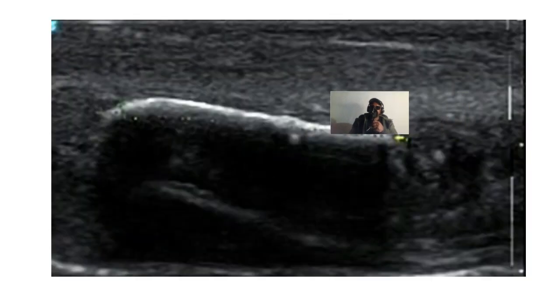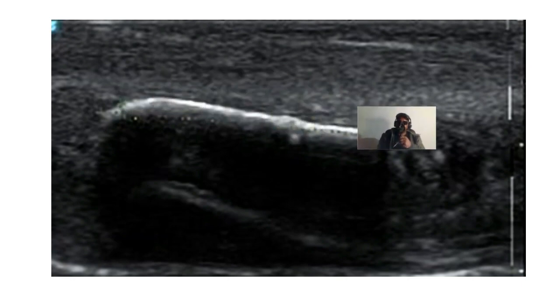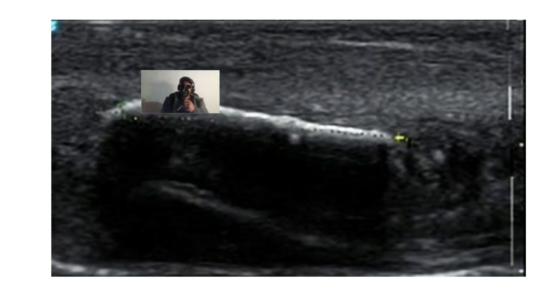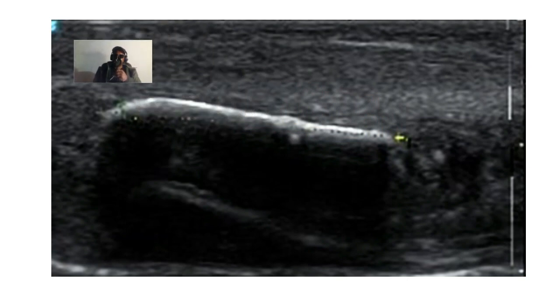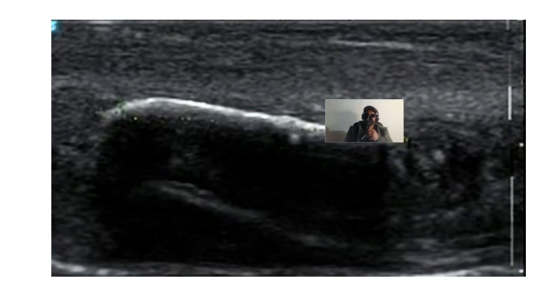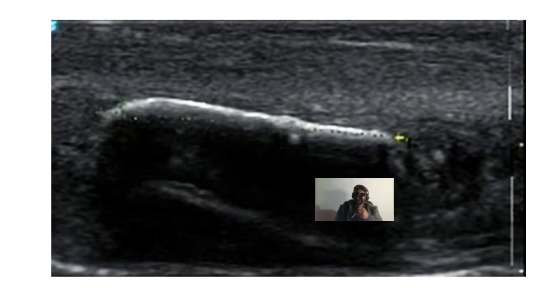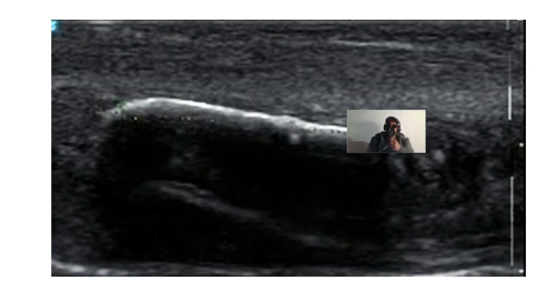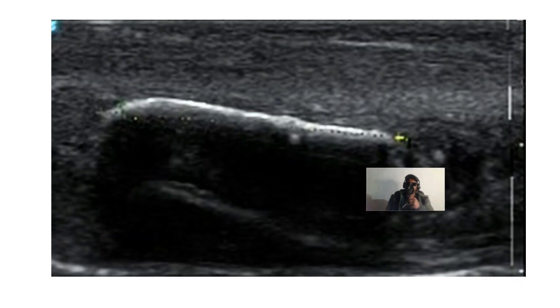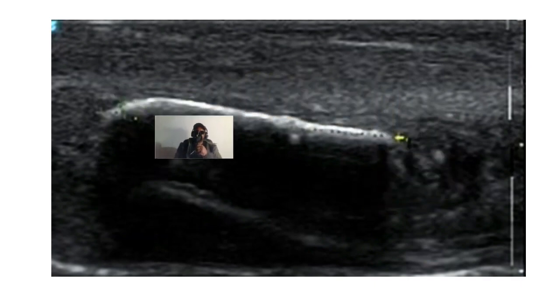So you can see here a longitudinal section in the tunica albuginea. You can see the calcification going all the way, and here the penile tissue is normal, and then you can see this calcification is echogenic and is casting distal shadows there. This is a calcification. So I think you can appreciate what we are seeing here.